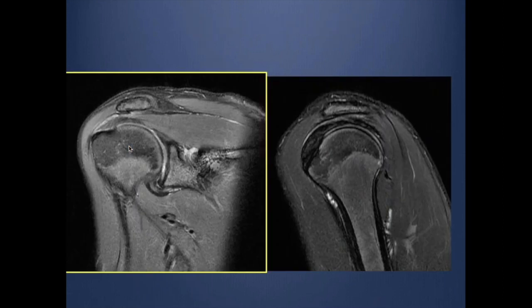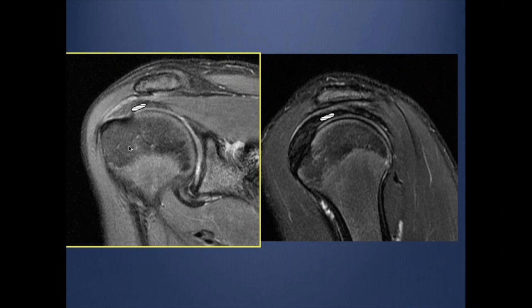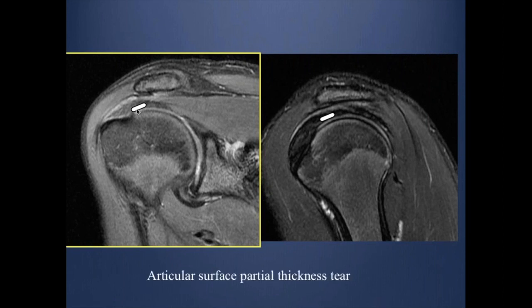If we look at the tendon here: the normal tendon has a bursal surface and an articular surface. If we get a fluid signal along the articular surface that does not extend all the way through, we call it a partial thickness tear because only part of the thickness is involved. In this case, since it is involving the articular surface, we call it an articular surface partial thickness tear.